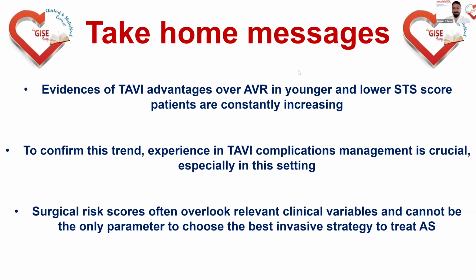Technically it's more complex, because if you look at the commander of the MyVal, I don't think you can cut where you cut. So I think it's technically more complex, and I don't know if it's feasible. I agree with Antonio. I don't know. So it's something that we should look for.